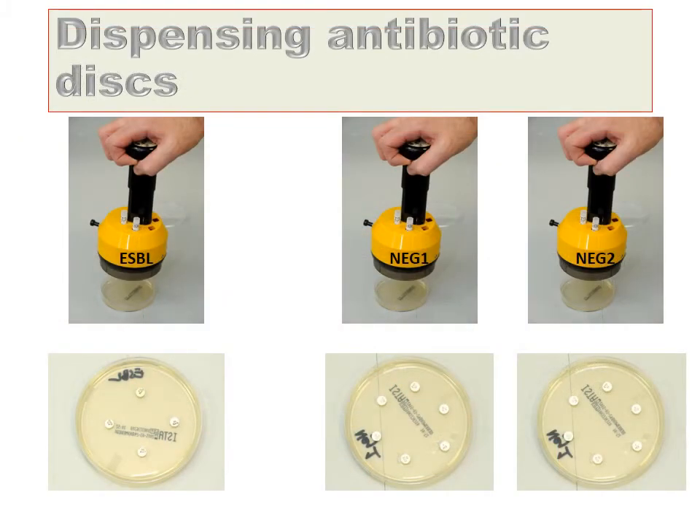The antibiotic susceptibility discs can now be added to three of the plates. Add the ESBL discs to the plates marked ESBL. Using the NEG1 and NEG2 disc dispensers, add discs to the two sensitivity plates which are neither marked gent nor ESBL.